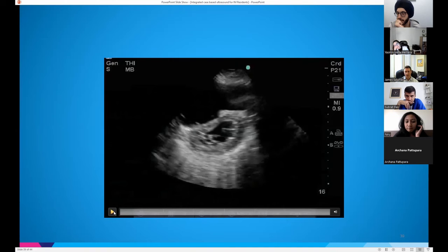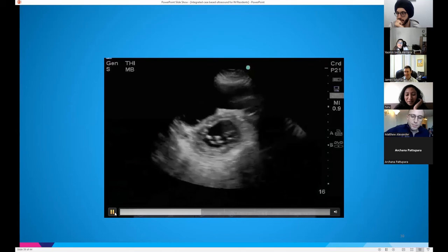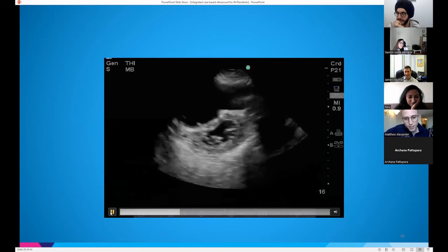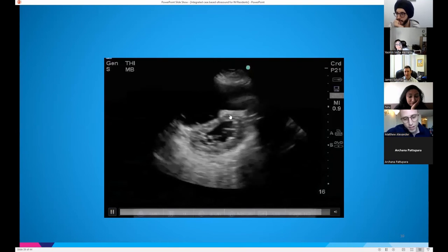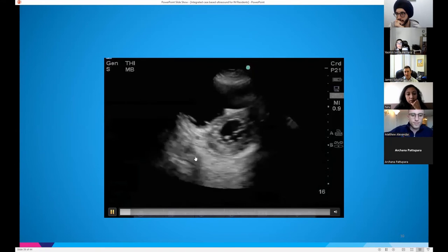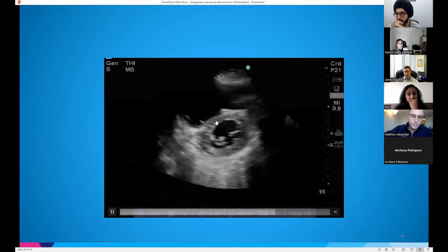What do we have here? Nero, is this going to be your case? Are you taking it home, or is Matt going to come in here? I see he just... Seems like there's bowing of the LV wall, septal wall. I gave you a perfect view right here. So if anyone wants to trace that out, that's a D. Yeah. Right. So LV, RV, we definitely see that paradoxical septal wall motion.